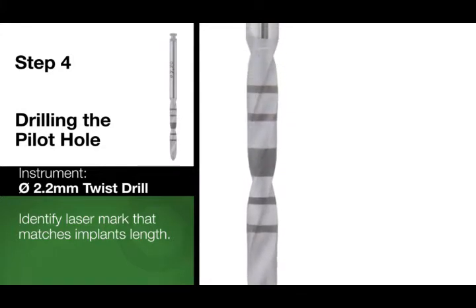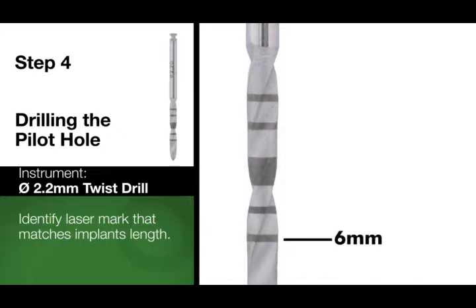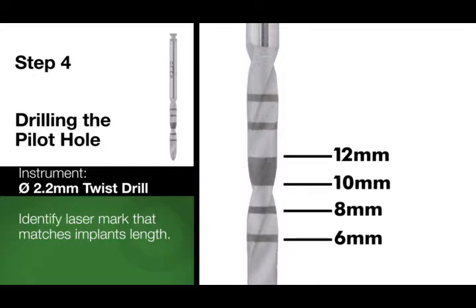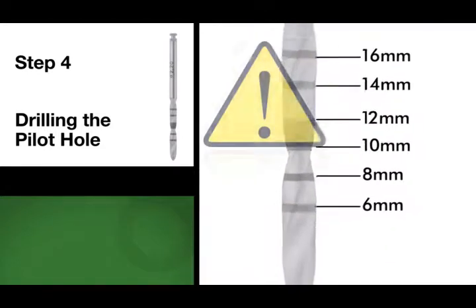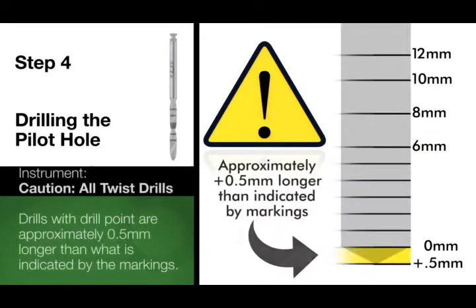Moving upward from the tip end to the latch end of the drill, the depth markings step from 6 mm to 8 mm to 10 mm to 12 mm and 14 mm. The final depth marking is 16 mm. The short OCTAGON twist drills do not include the 14 or 16 mm markings. It is important to note the surgical twist drills included within the Infinity OCTAGON surgical kit are approximately half a millimeter longer in apical length than what is indicated by the markings on the drill.